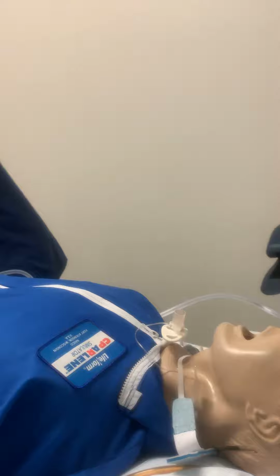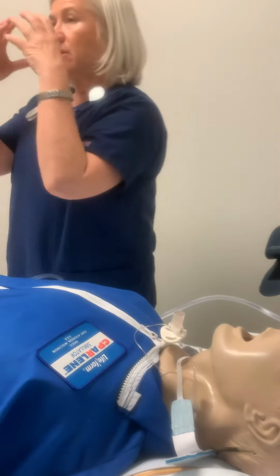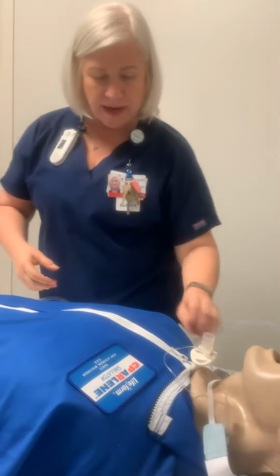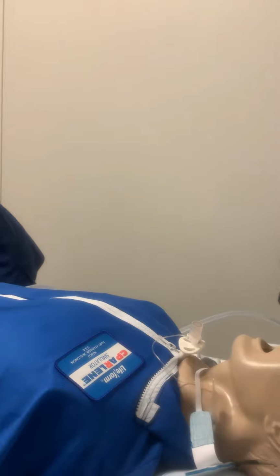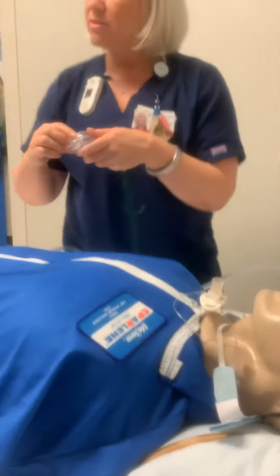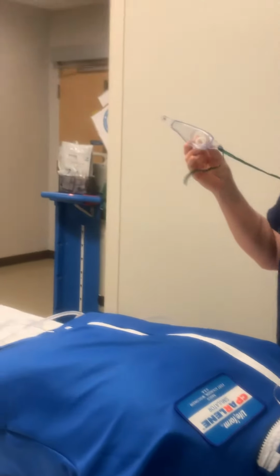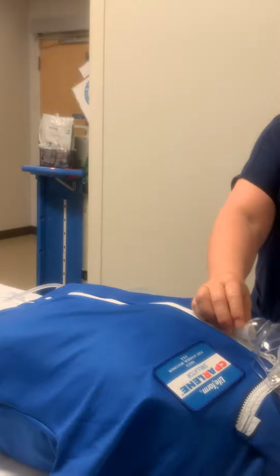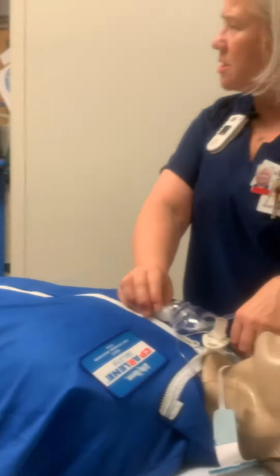So, I always like to wear a face mask with a shield because if you take, say they have a trach collar on them, which I don't know, do you always use trach collars over here on your patients when they come out of procedures or anything? They might have a trach collar. Do you use any oxygen on them at all?